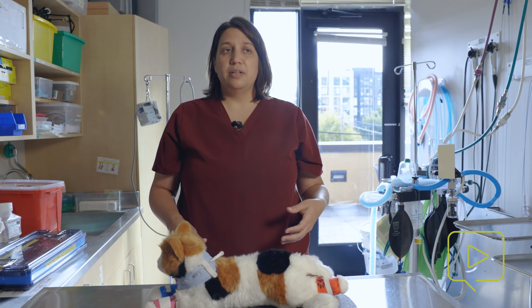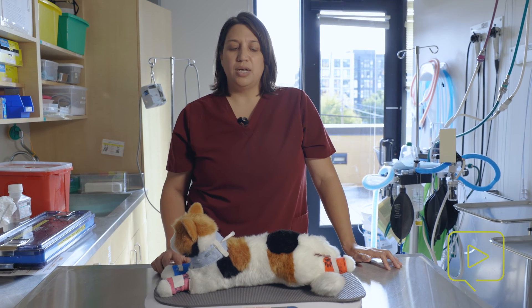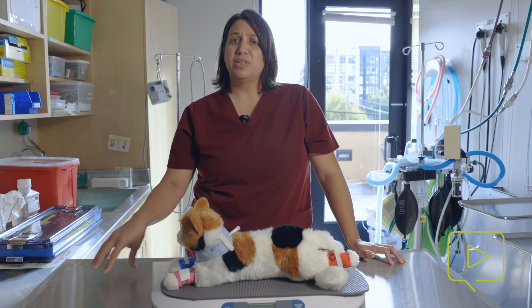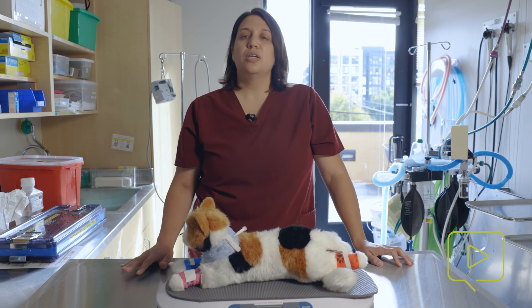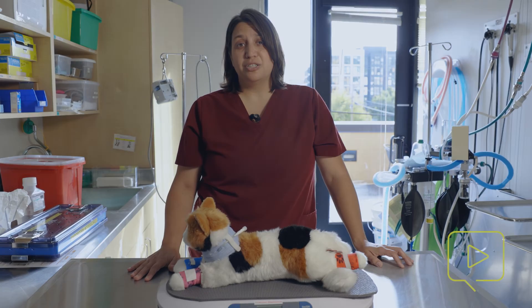If you take those few precautions — making sure the surface is flat, that the animal is in the center of the scale, and that you're tearing it — you should be able to get successful weights. It is really important that accurate weights are being taken on our patients. In the times of technology, one weight becomes the dose of many medications when we're using electronic software. I put a weight in and it calculates all the doses of the medications, but that one weight, if it's wrong, can be really detrimental to the care of the patient. So make sure that you're giving this the attention it deserves and you're being careful and getting accurate weights on your patients.